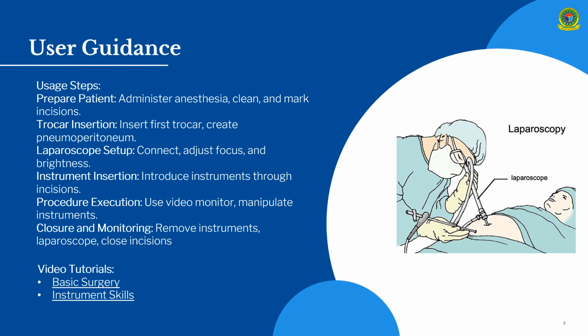Then we also remove the gas, which was used to create the working space. Then we close the incision to complete the total process. Then I have provided some video links below, and these videos show how this laparoscopy procedure is performed in a real world scenario.